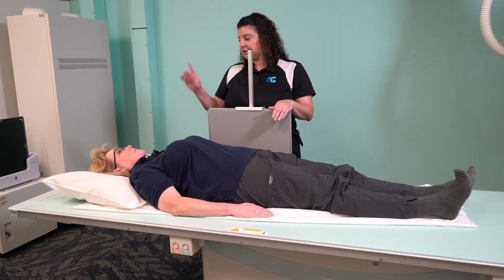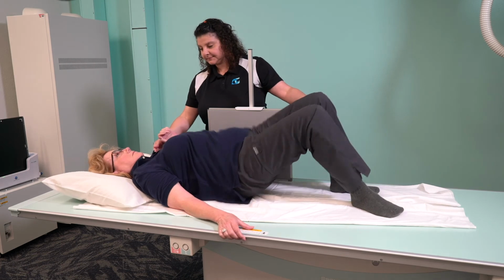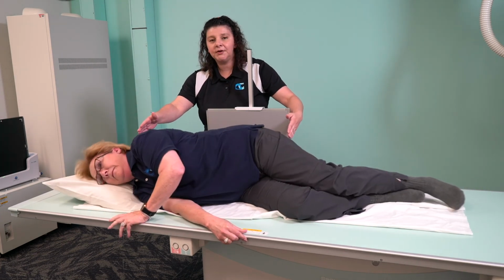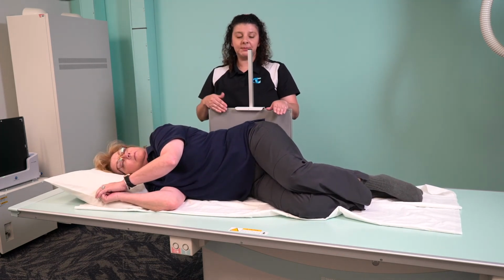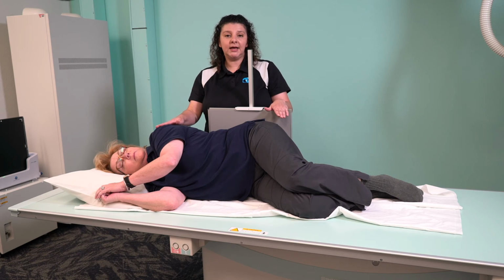Okay, now if you'll lay onto your right side facing away from me. Because my central ray is horizontal and my image receptor is perpendicular, this is going to be a right lateral decubitus, because my patient is laying on her right side and my central ray is horizontal.